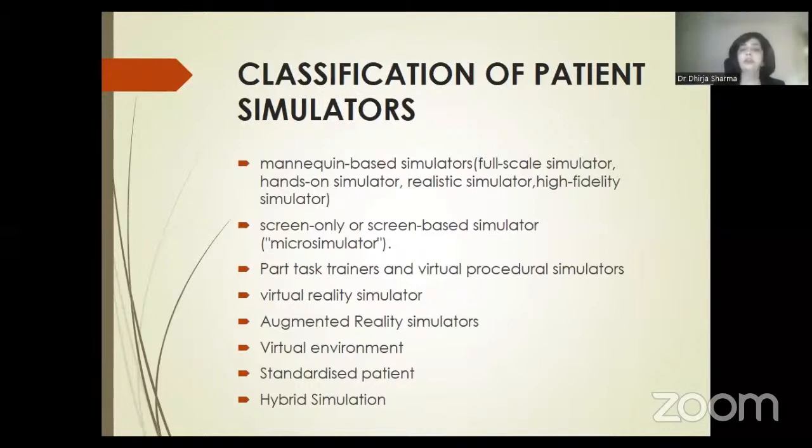Virtual procedure simulators are used quite often by the surgeons. The virtual reality simulators and augmented reality simulators are newer modalities, and we'll be talking about them. The newest development is having a complete virtual environment, which is totally computer-based.